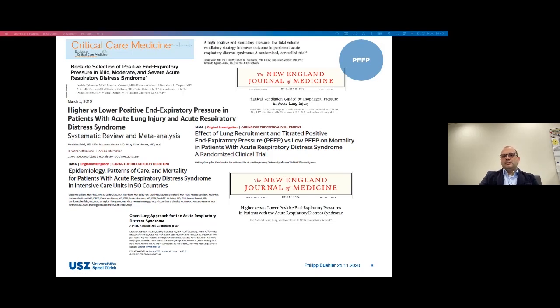Currently, in the literature, it is still unclear where the best PEEP is. However, we will learn new concepts for this from my colleague in the following sessions. In our experience, we initially applied elevated PEEP levels, especially in the L type, and noticed over the course of time that especially in the early phase, PEEP should be limited to between 8 and 10 millibar, or measured and assessed by means of PEEP titration or an esophageal probe.